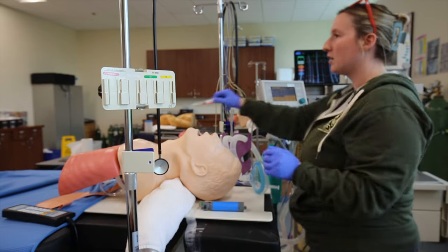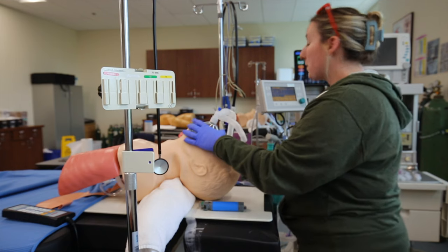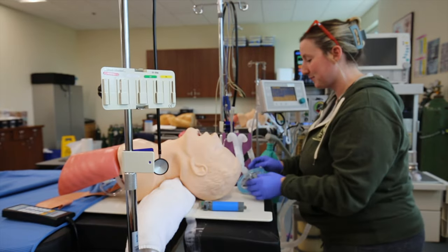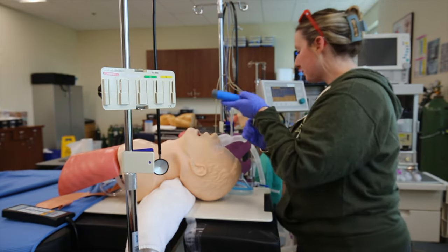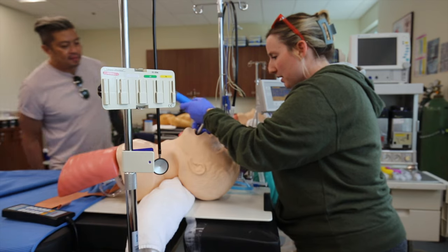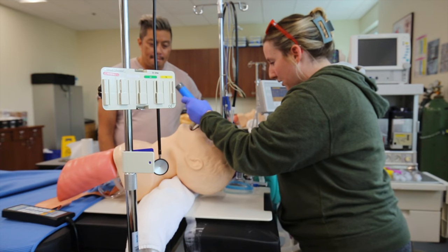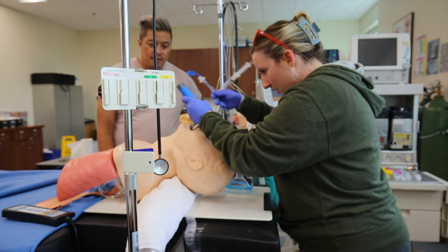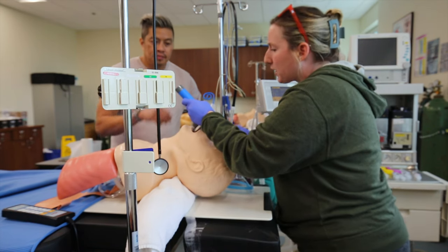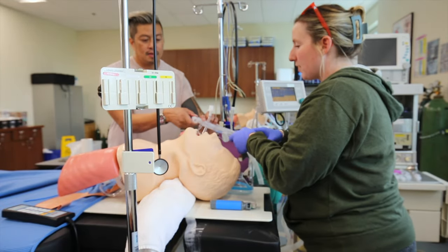I'm pushing my rocuronium. We're going to wait — we're still ventilating — 60 to 90 seconds for rocuronium to work. It's been 60 to 90 seconds, so we're going to intubate. I'm going to scissor the mouth, put my Miller blade down, visualize the epiglottis, lift the epiglottis, and I have a grade 2A view. Tube is past the cords. We're going to inflate the cuff.